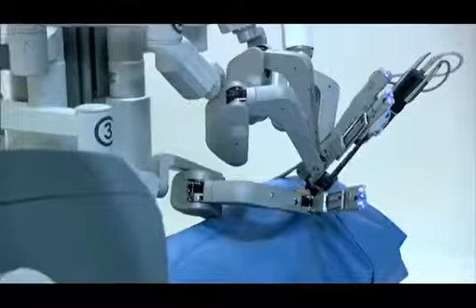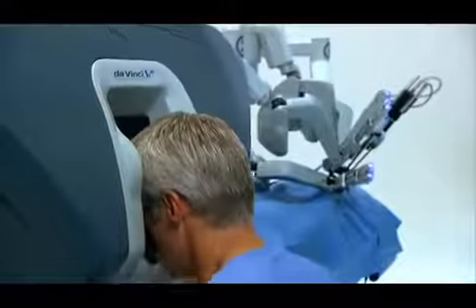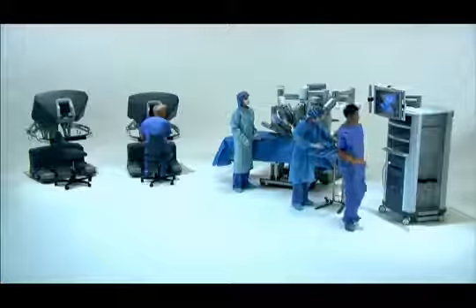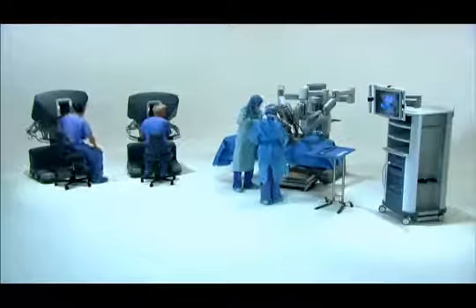Her surgery was performed with the Da Vinci, a robotic system that allows doctors to manipulate robotic arms to make five very small incisions. Four allow cutting and sewing, and a fifth has a camera, so the surgeon can see what's going on. The system is less invasive, particularly for gynecological procedures.